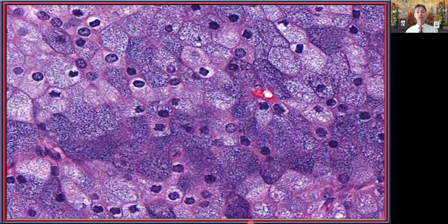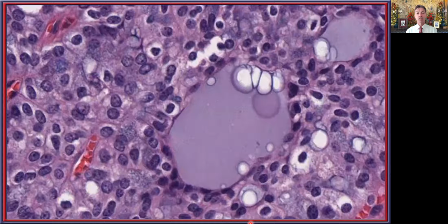So again, when you look at these neoplastic cells, this is the serous acinar differentiation that we all look for in the tumor, and it needs to be identified somewhere. I think you will see that they're very coarse granules. They're easy to identify on a standard H&E. This happens to be at 40x, but even at 20x, you can certainly see the well-developed granules in the cytoplasm. However, as I look at this and begin to see the non-specific glandular cells and some of the intercalated duct type cells, you can tell that there are isolated cells in this group that still have the area of serous differentiation with nice granules present in the cytoplasm.